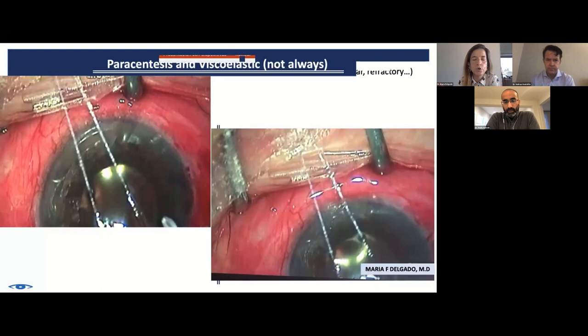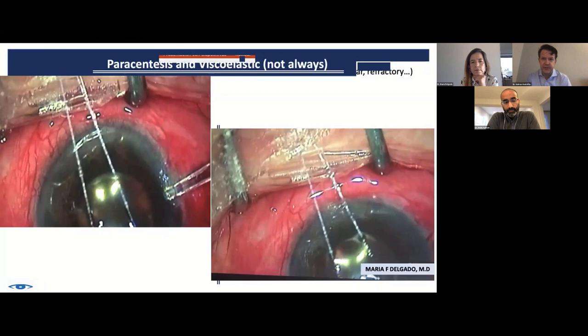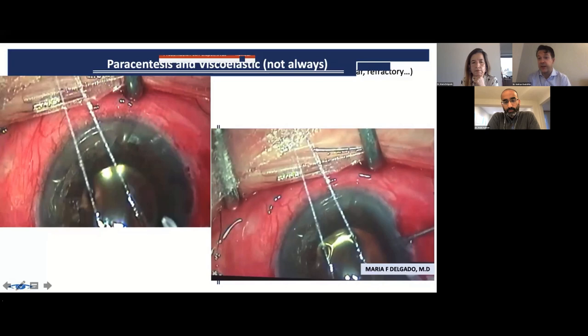Yeah. What do you do, Nate? What viscoelastic do you put in? I use Provisc. I think Healon is acceptable. And if I'm not mistaken, I even know some surgeons who use Viscoat. So I think you have some choices here. I would personally stay away from something like Healon 5 or even Healon GV, unless I knew I was headed for hypotony, like the other eye had a bad problem. So I use Provisc.